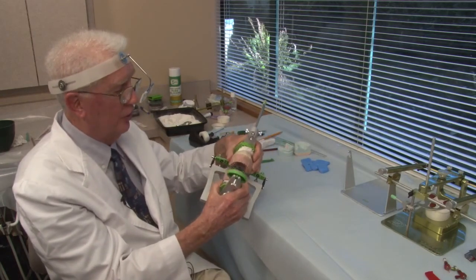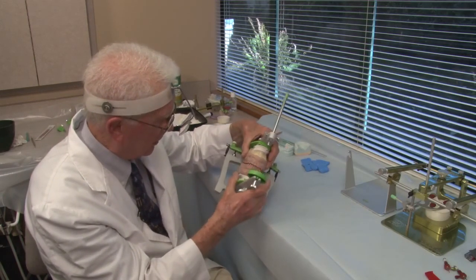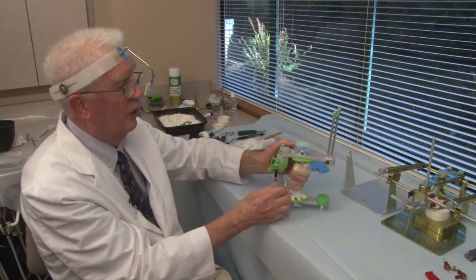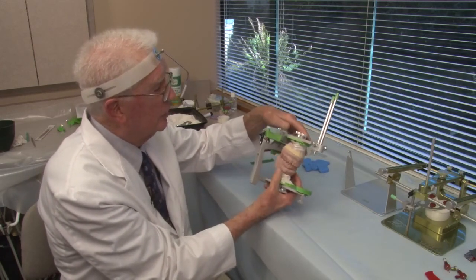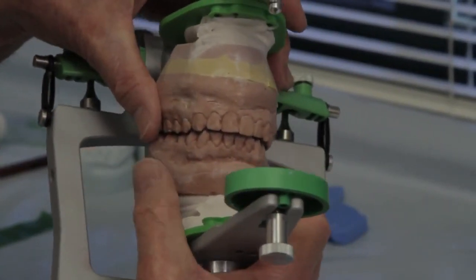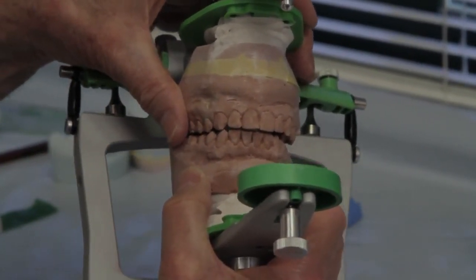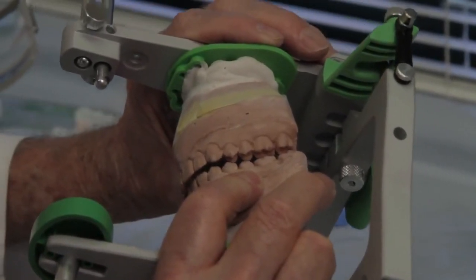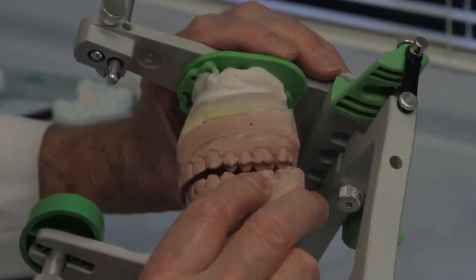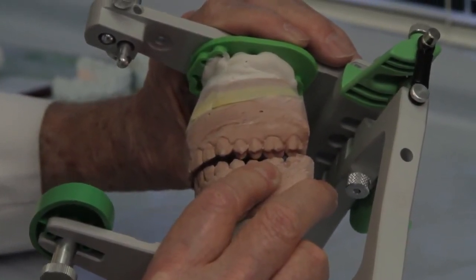Let's see if I can demonstrate one other thing. I'm going to see if I can move the articulator and show you what a balancing interference is. So I unlocked the centric and the centric latch, and I'm going to move the patient into left or right working. And when we move the teeth into right working and we look at the left side, you can see how the posterior teeth, look at the first and second molars on the left side, they're rubbing. That's the way wear facets develop.